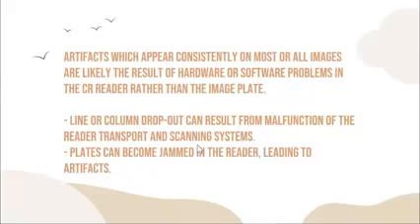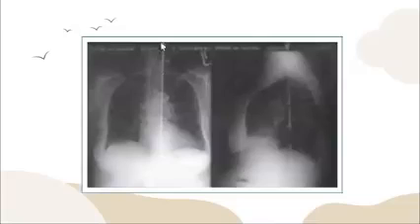Line or column dropout can result from malfunction of the reader transport and scanning systems. Plates can become jammed in the reader, leading to artifacts. Okay? So line or column dropout. That means that your pixels, wala nag-malfunction siya. Okay? So dapat good ang image ani is kani siya diri na area white, kani black, kani diri kini mga grayish na color. Okay? So because nag-malfunction yung pixels na kanina linyahan, okay, yan yung ihang gawas.